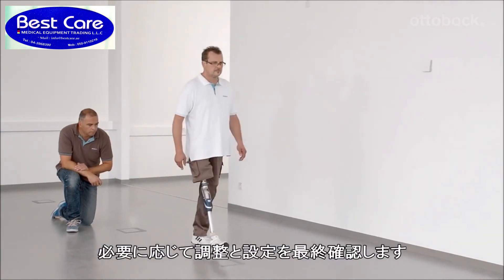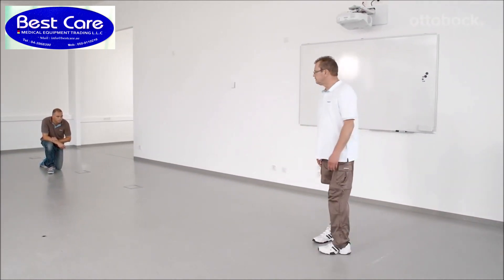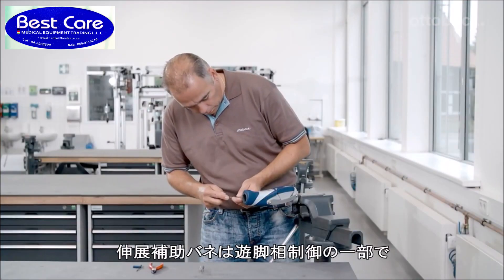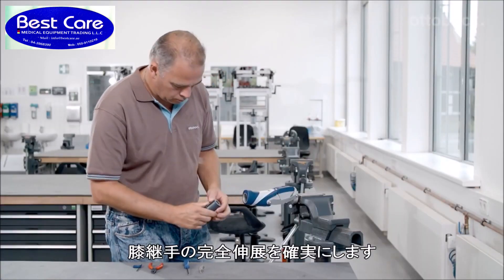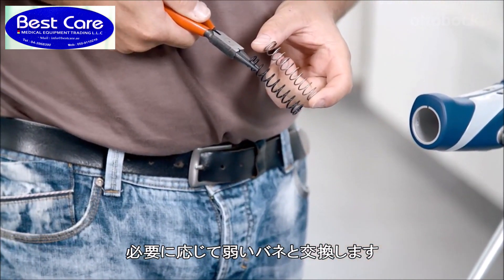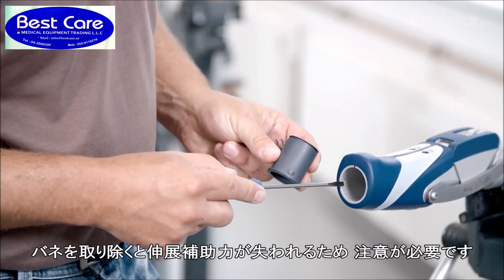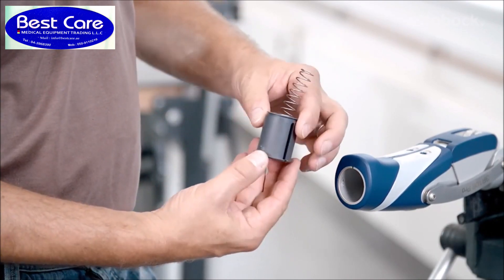Finally, double-check all of the settings and adjust them if necessary. Now the knee is set optimally for the end user and further walking exercises can be completed. The integrated extension assist spring is part of the swing phase control mechanism and ensures extension of the prosthetic knee joint if required. The installed strong compression spring can be replaced with the weak compression spring or omitted entirely. To prevent injuries due to falling, this is only permitted if the patient is able to bring the prosthetic knee joint to full extension prior to heel strike in all situations.